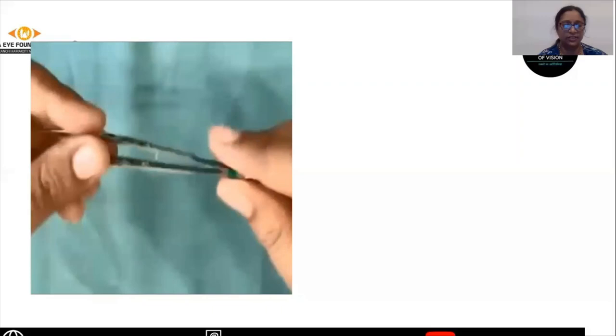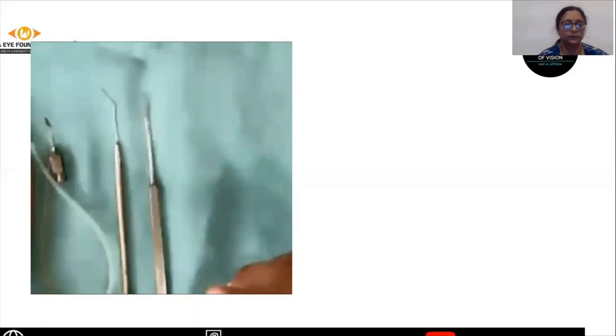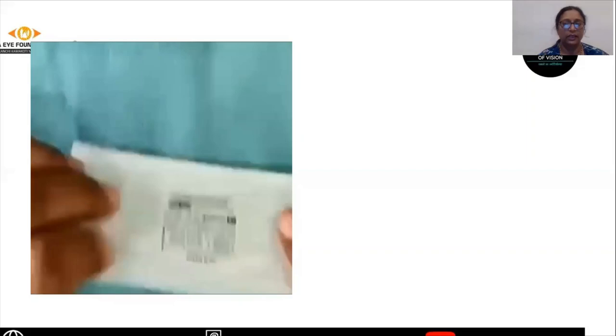Once the PI is done, if you have to do cataract extraction, we will need the following instruments for cataract surgery: the vectis, the Sinskey hook, the Simcoe for cortical aspiration, and the McPherson forceps for the IOL insertion.